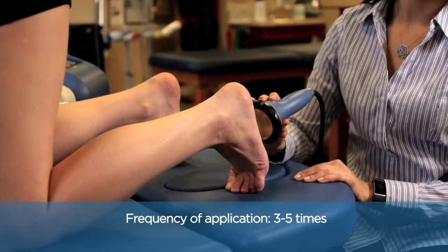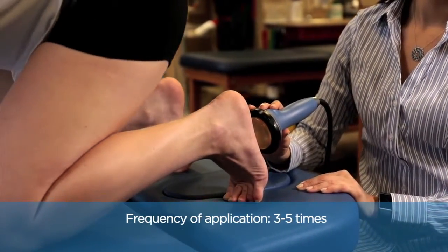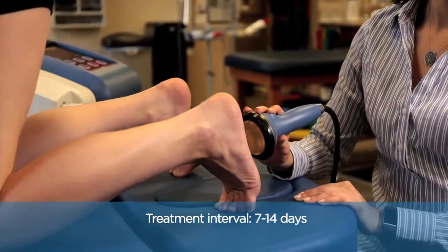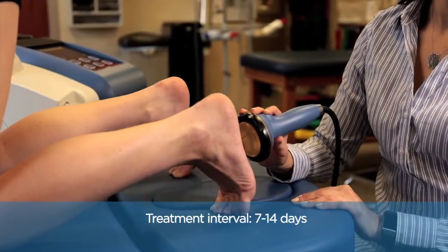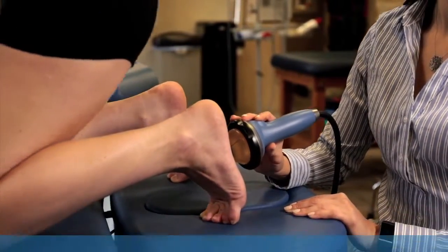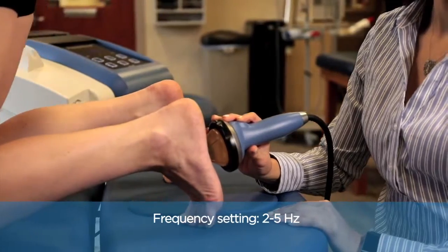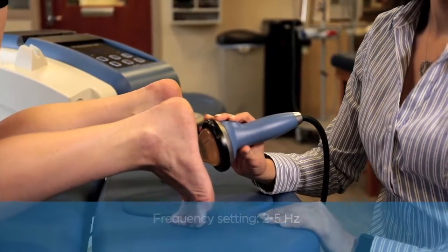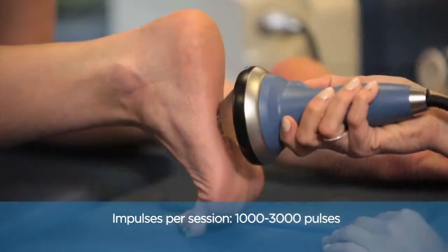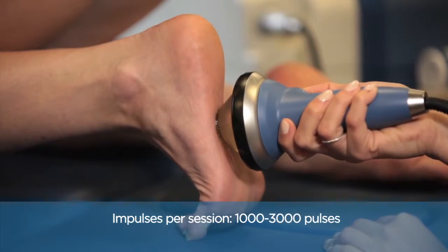Frequency of application: 3 to 5 times. Treatment interval: 7 to 14 days. Frequency setting: 2 to 5 hertz. Impulses per session: 1,000 to 3,000 pulses.